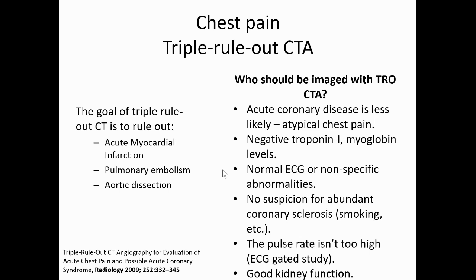And as a clinician, if you suspect pulmonary embolism, the CT technique will be completely different than if you are telling the radiologist that you're suspecting an aortic dissection. So please remember that for every clinical question, a CT protocol might exist.